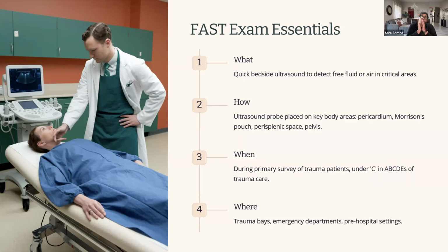Now, let's talk about where the FAST exam is performed. This is a bedside tool designed for use in trauma bays, emergency departments, and even pre-hospital settings like ambulances or helicopters. Its portability and speed make it ideal for any situation where rapid assessment is critical.